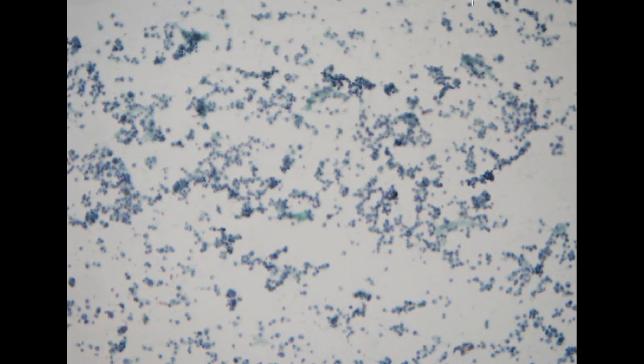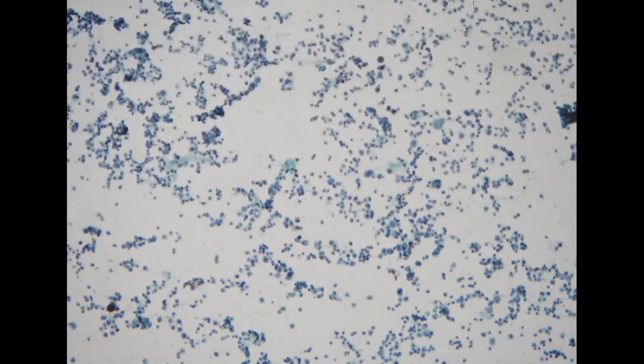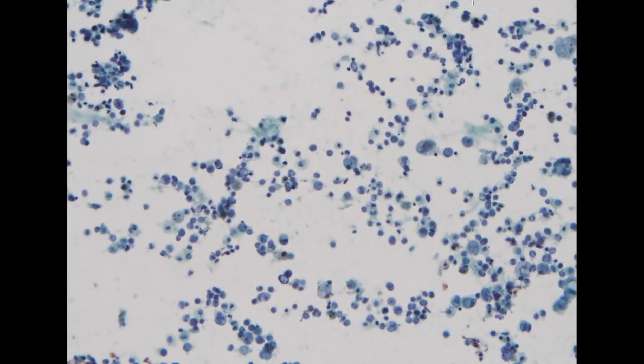On low power, we do see hypercellularity, and we do not see aggregates or tight clusters of cells that we usually see in a metastatic adenocarcinoma.